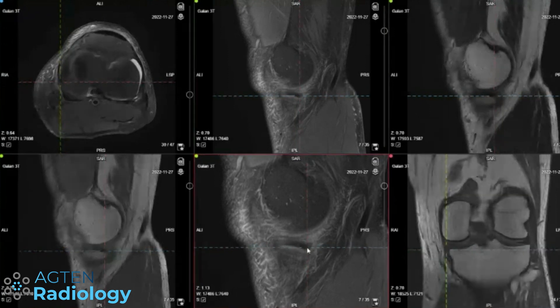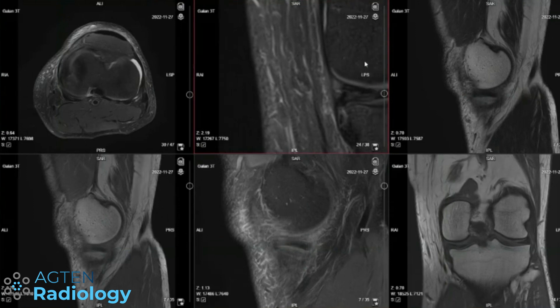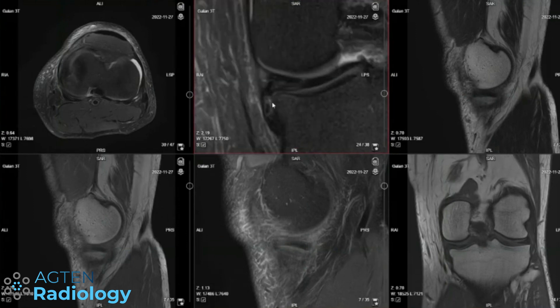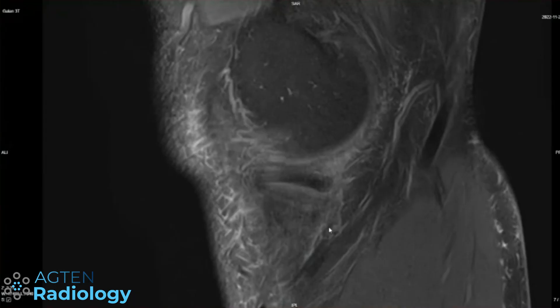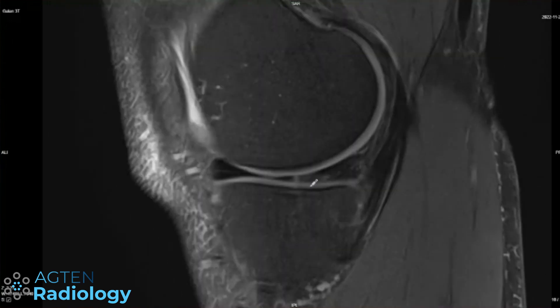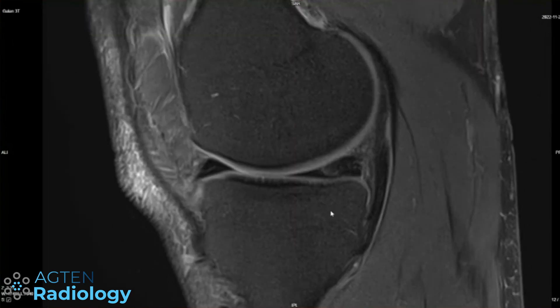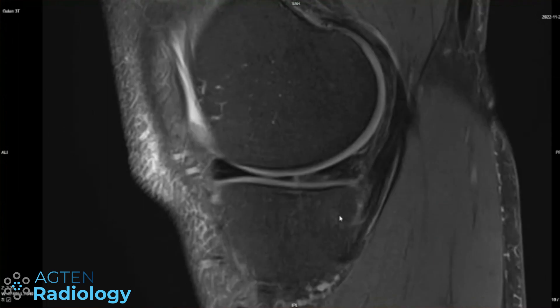We can also see this on the coronal view — here, this one. It's going a little bit over the edge because it's fragmented, and creating a little bit of irritation of the posterior middle joint capsule here with this edema. So I would just go with 'complex' — we have all these different lines and components, and I don't really try to put it in just one category.